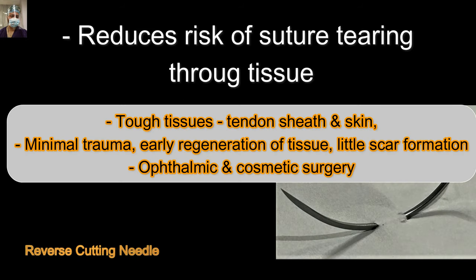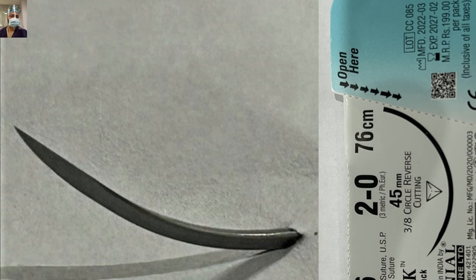This is a closer view of the needle, showing the triangular section of the cutting edge — and it is not the whole length of the needle. Only the last part, usually one-third of the needle length, has a cutting edge; the rest is a normal flattened surface. The cutting edge is towards the outer side — so for tough tissue like tendon, sheath, and skin. As you pass the needle through tissue, there is no cutting edge towards the wound margin, so there is less tearing. This 2-zero silk suture is a reverse triangle — the cutting edge is towards the outer side. The 45 mm written on the leaflet is the length of the needle shaft, and three-eighths is the circle part used.